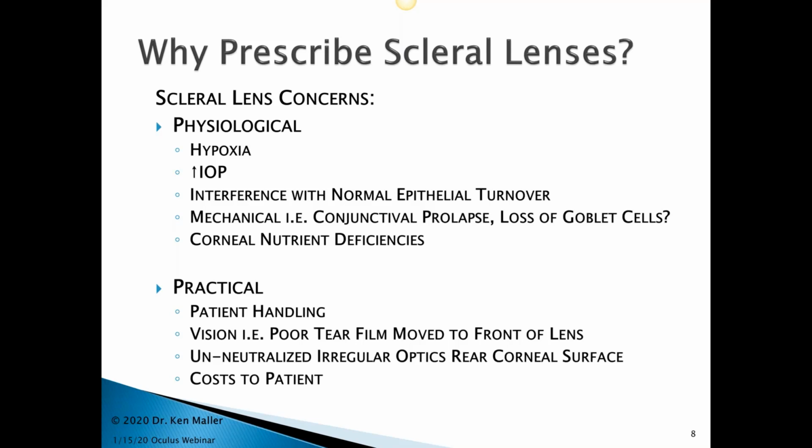Tear layer function is meant to be in contact with a cornea to properly bring nutrition as well as to remove metabolic waste. And because we have more of a stagnant type of environment, this is something that we certainly have to be on the lookout for.